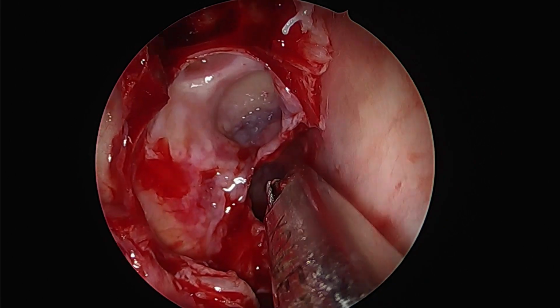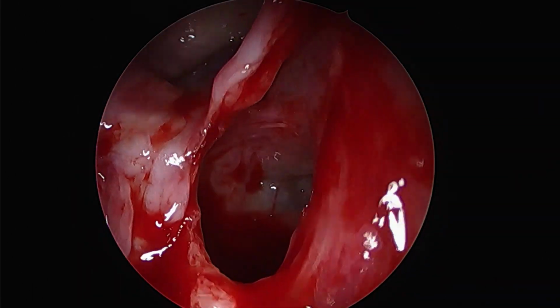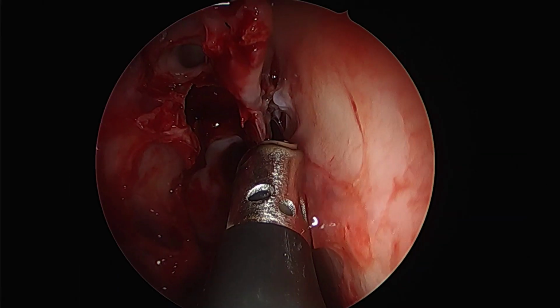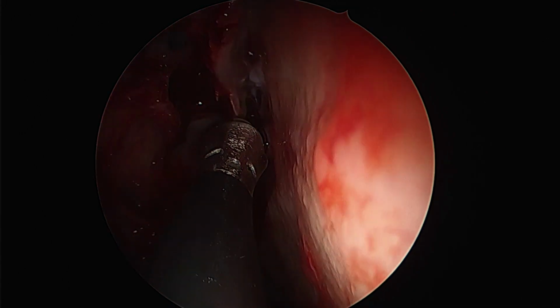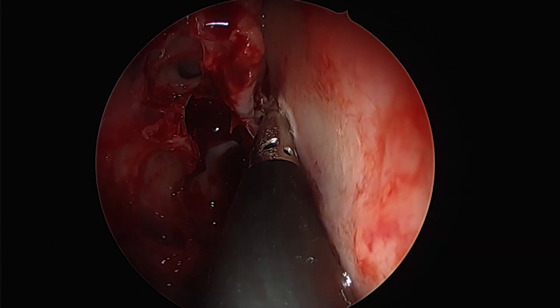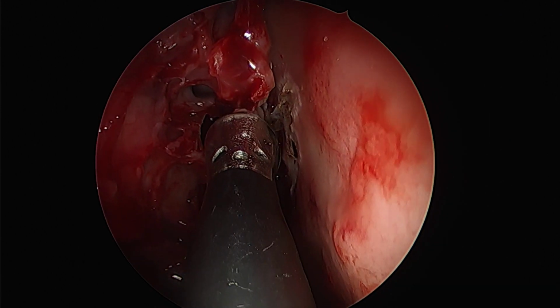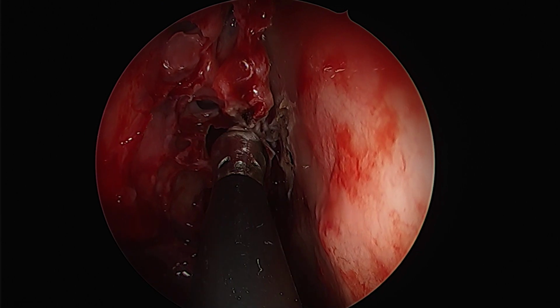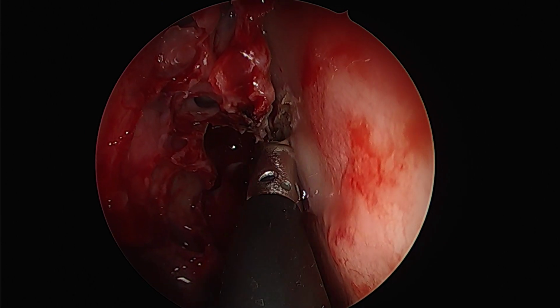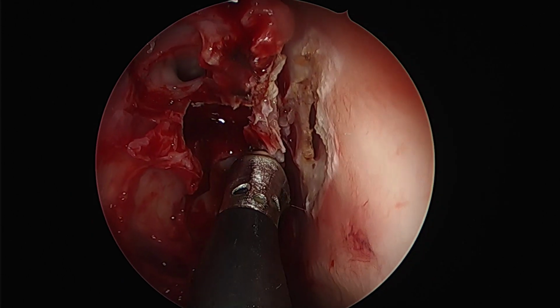So the point is also the fact that when we are doing a repair on the cribriform plate, we must also open all sinuses reasonably widely so that our reconstruction, that is fat, fascia or mucosa, should not cover any unopened sinus or create a mucocele or sinus obstruction and sinusitis. So opening of the frontal sinus, the sphenoid sinus and the ethmoids widely is highly recommended and is very important to avoid any long-term complications.